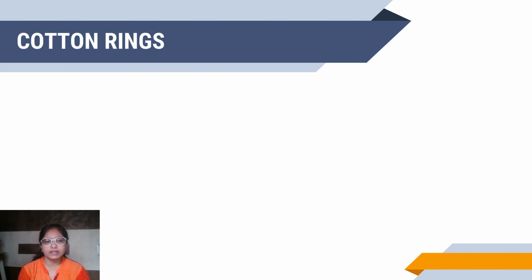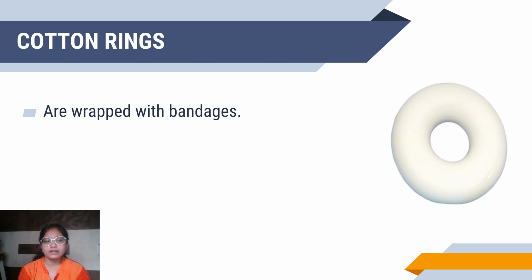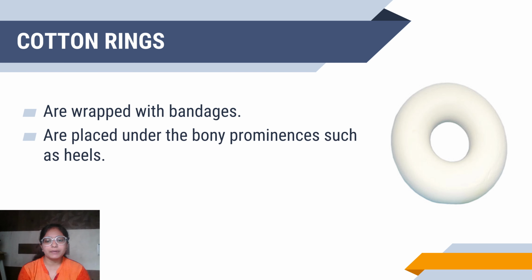Next is cotton rings. This is the picture of cotton rings. Cotton rings are wrapped with bandages on the outside and are placed under bony prominences such as heels.